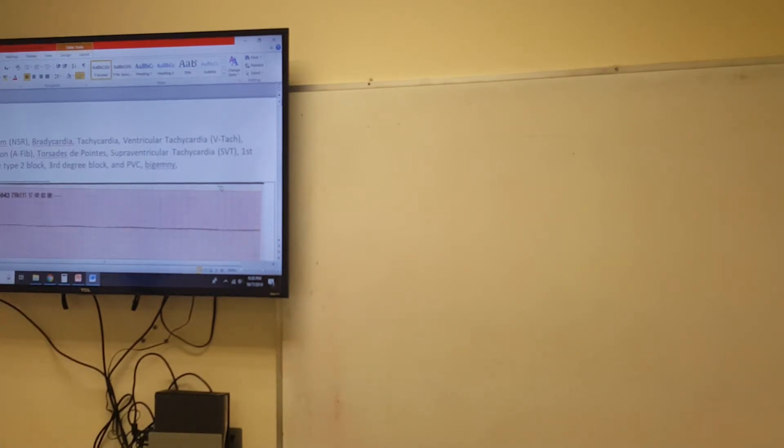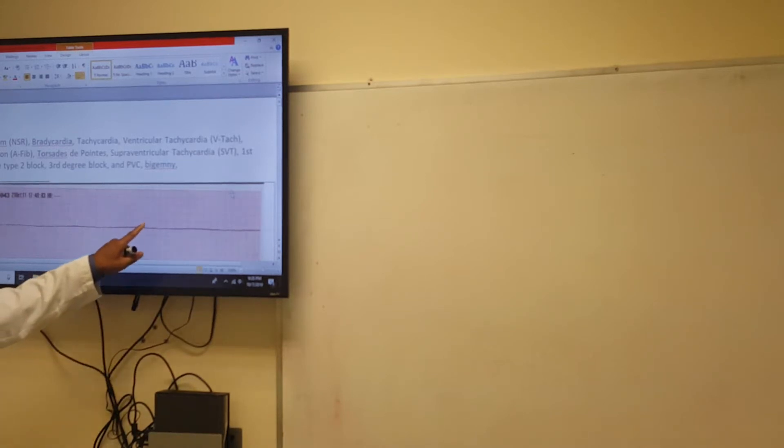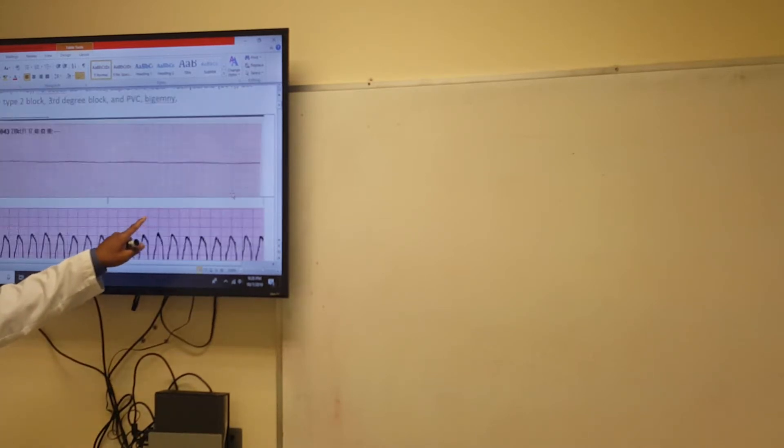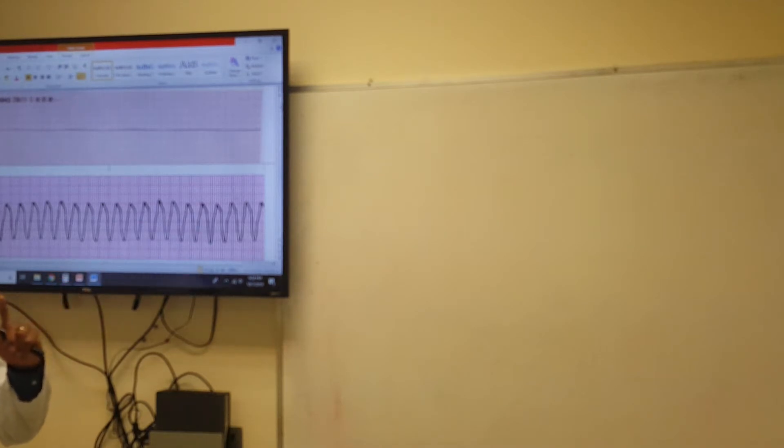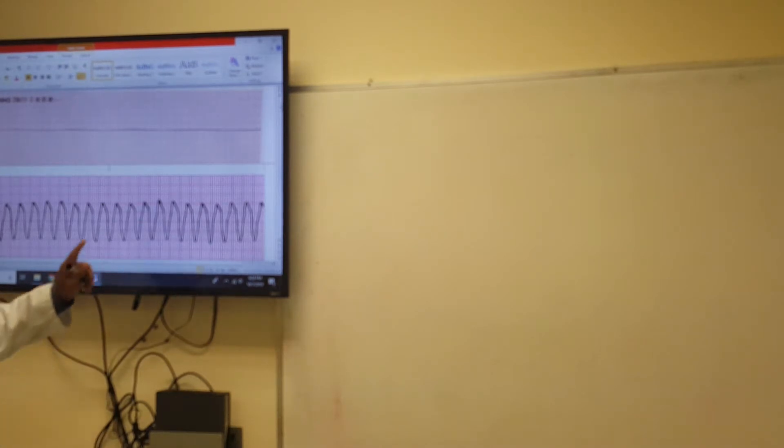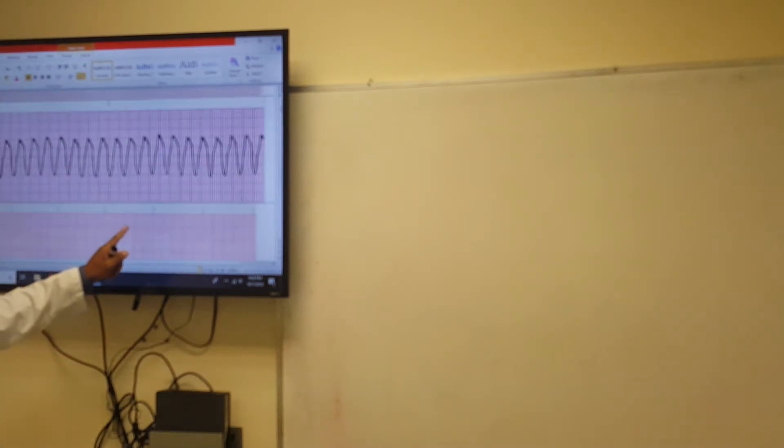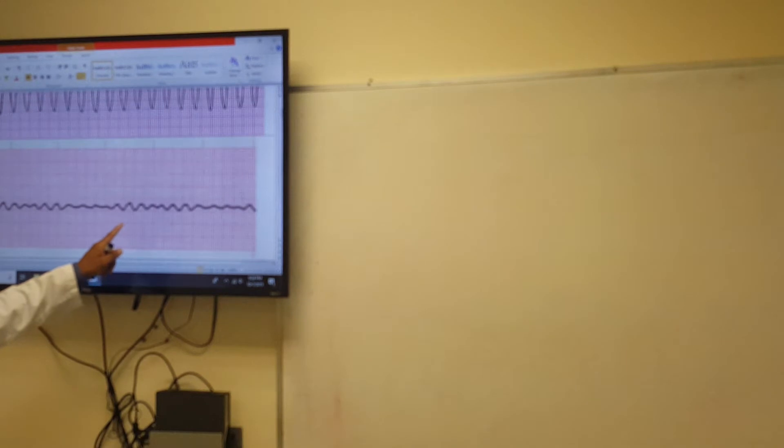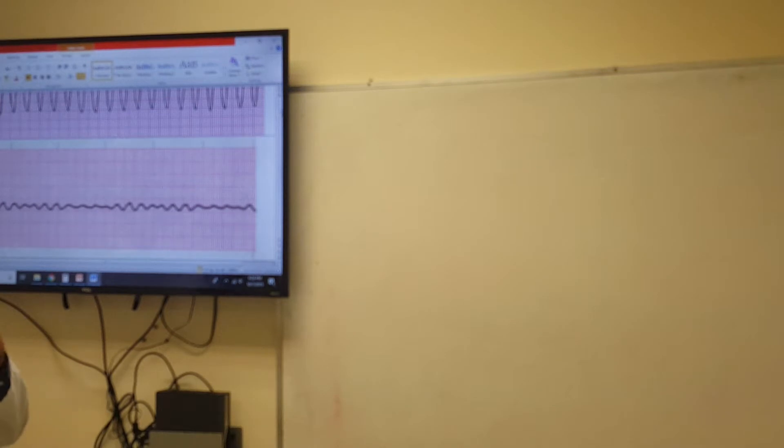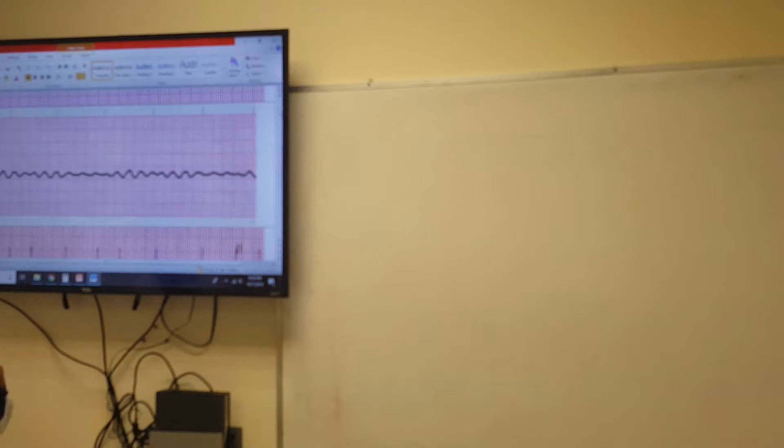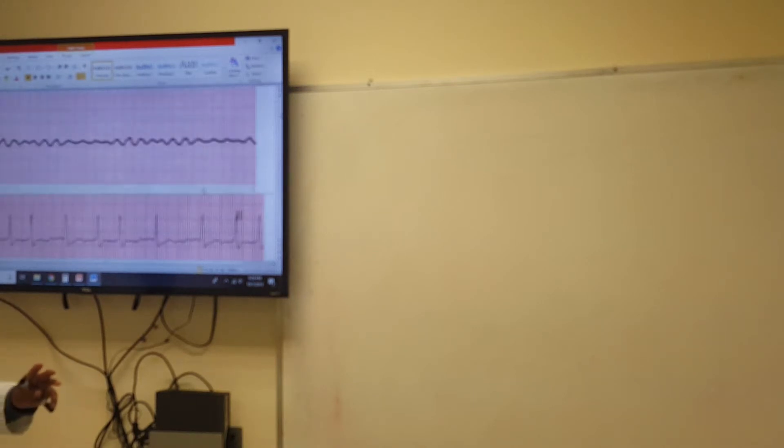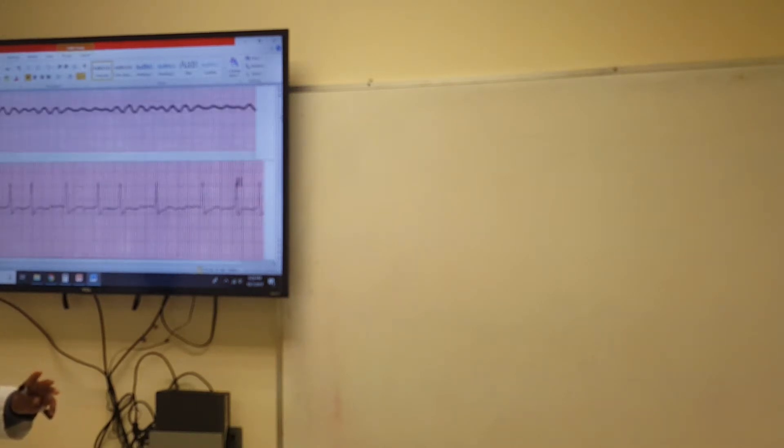Right here we've got asystole. Let's scroll up. Which one? Ventricular tachycardia, V-tach. Great. And how about that one? V-fib. Good. Now that was our trinity of lethal dysrhythmias. All right, now let's go to this one.